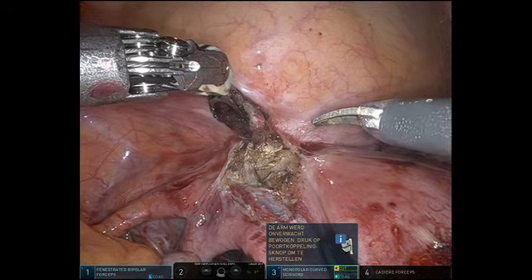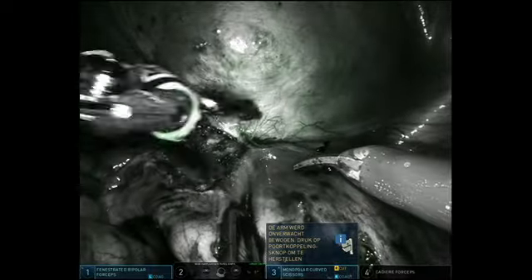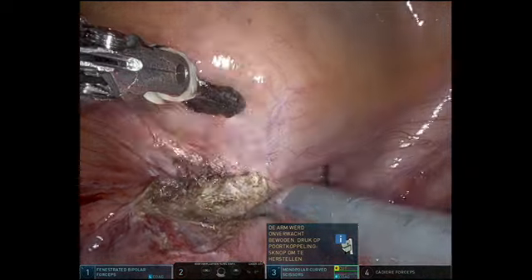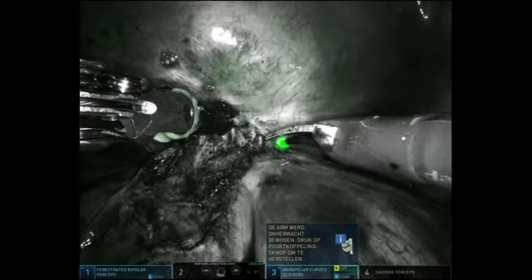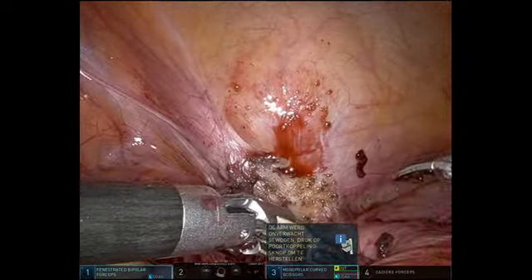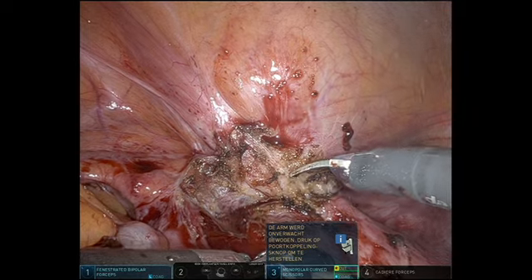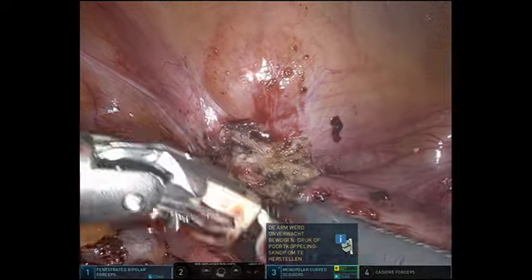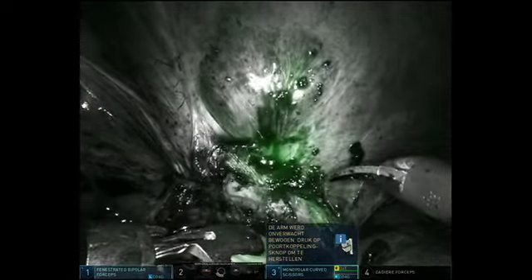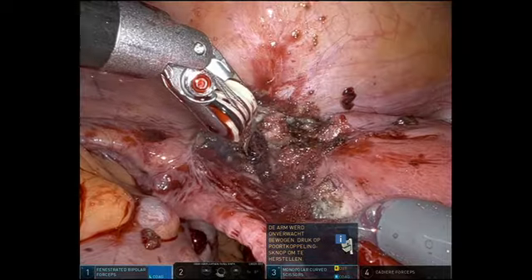The approach for a central nodule is going first laterally. Lifting of the peritoneum with unipolar scissor, dissecting further, deeper. Then we go on the right side. Releasing the nodule superficially. Slowly you will see some transparency of the bladder wall because it becomes thinner, because we are dissecting in the muscular layer of the bladder.